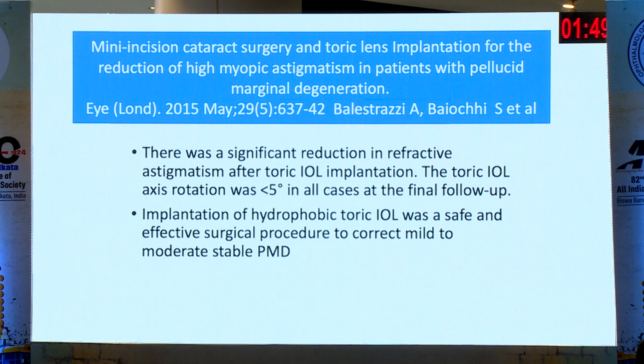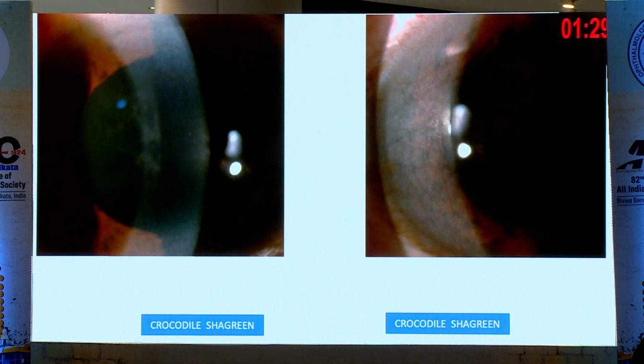Either the patients can undergo cross-linking or intracorneal ring segments, or partial thickness LK or DALK, or a large diameter PK. The corneal independent interventions can be spectacles, or initially RGPs, later scleral lenses. And in fact, toric IOLs have been described as a method to handle the astigmatism in PMDs also.